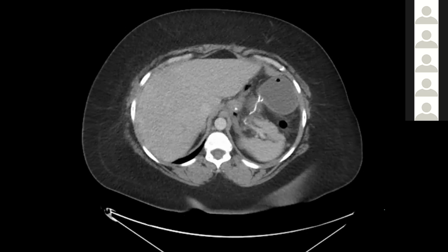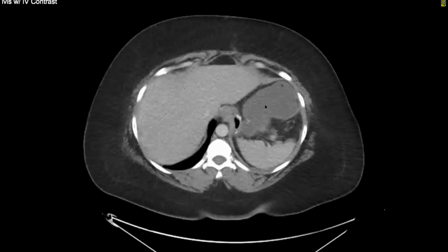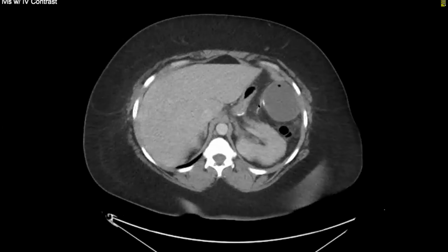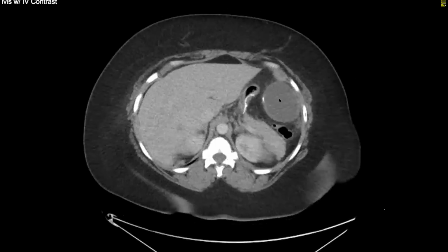Yeah, so exactly. For a sleeve gastrectomy, they normally resect along the greater curvature, sorry, my mouse is having issues, and then they'll remove the excluded stomach. So there shouldn't be any excluded stomach here. Whereas in this case, you can see that this is the suture line along the greater curvature of the remnant stomach. And then this is a tubular structure that also has suture material along it. It's fluid filled. So that is the excluded stomach that should have been removed.